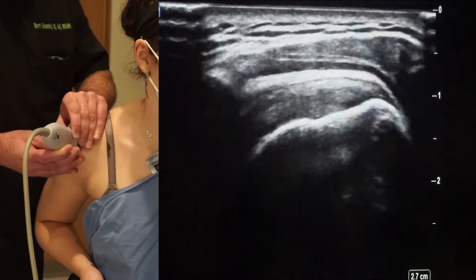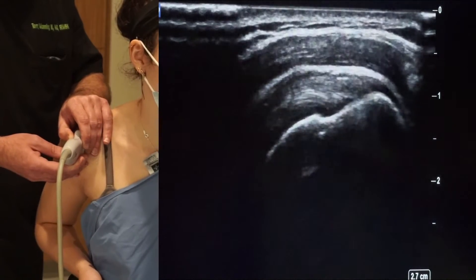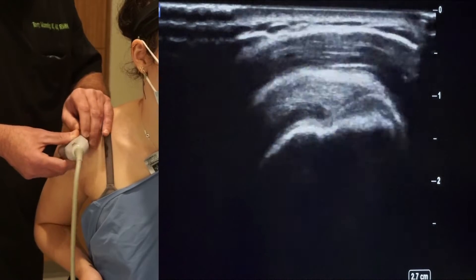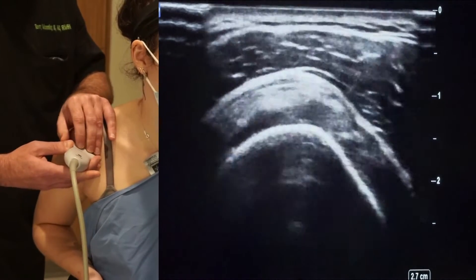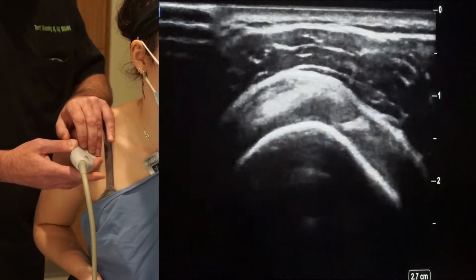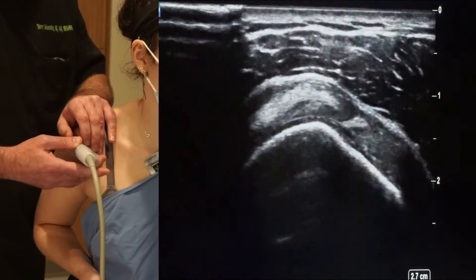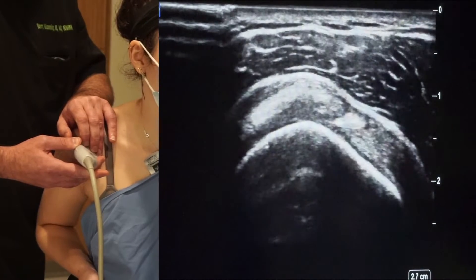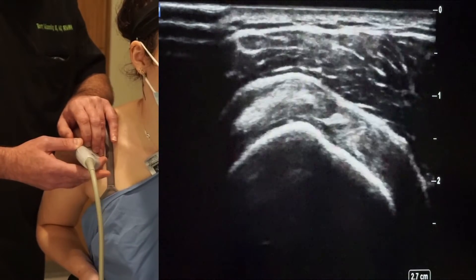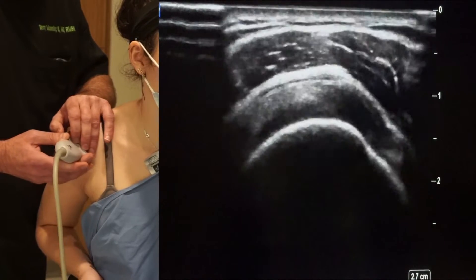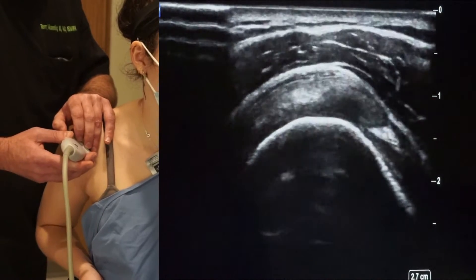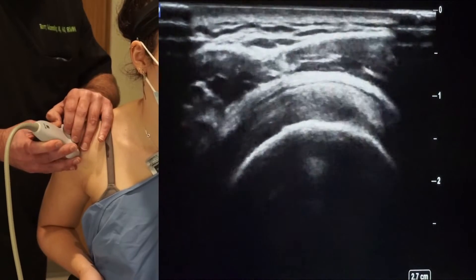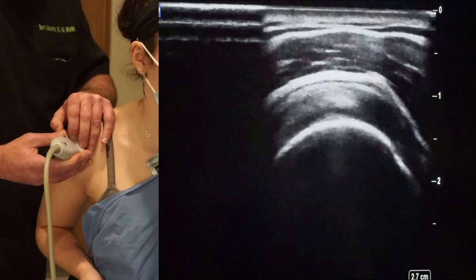We've looked at this in long axis. All structures are evaluated in two planes, so we rotate the probe 90 degrees and get the supraspinatus tendon in short axis. In short axis, the bright white divot on the right of the screen is the biceps tendon; deep to that is the subscapularis tendon; over here is the supraspinatus tendon; and over here is the infraspinatus tendon. We call that the tire on the rim view.